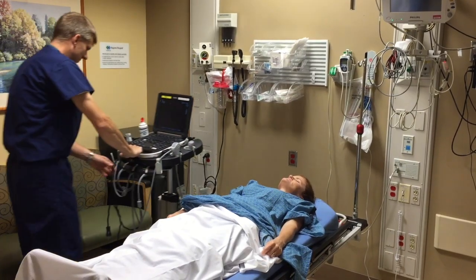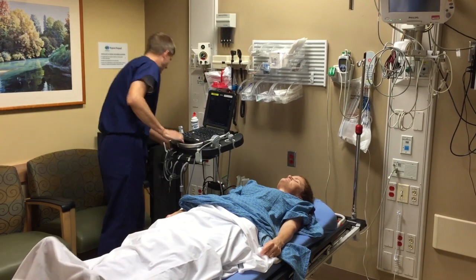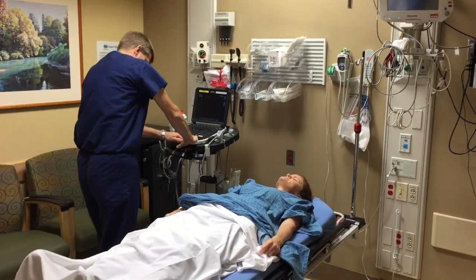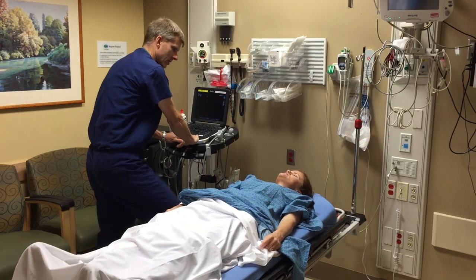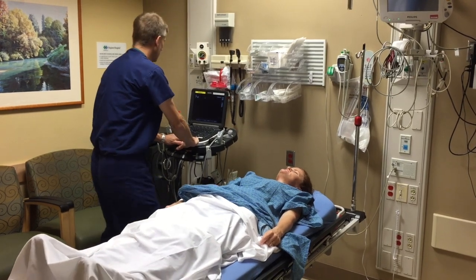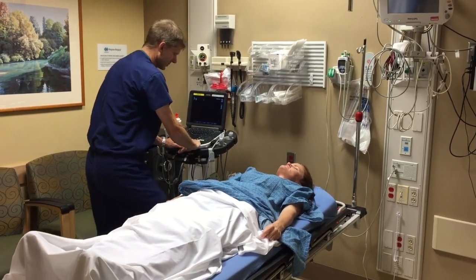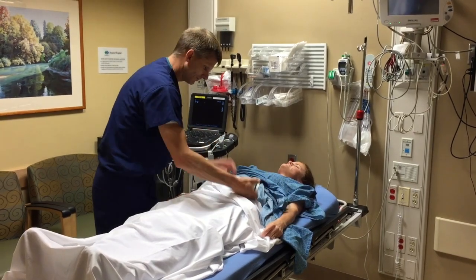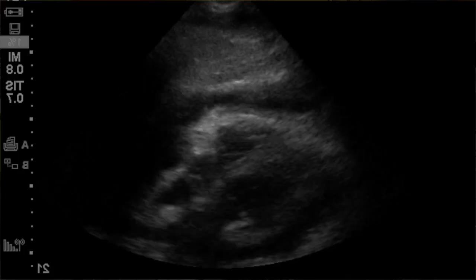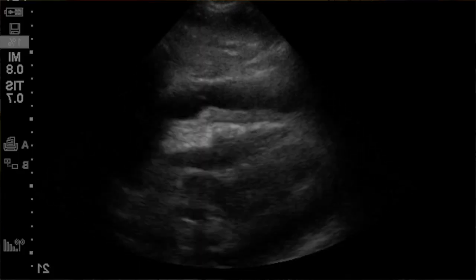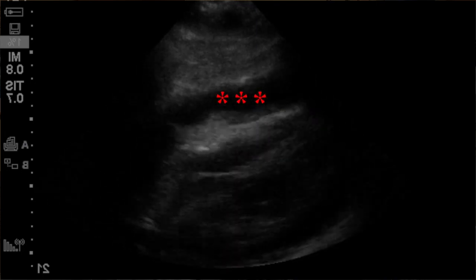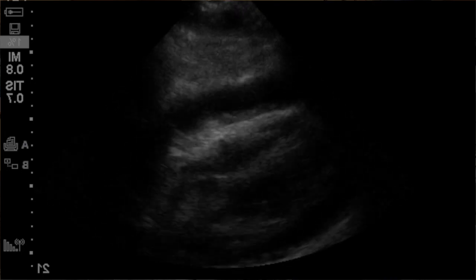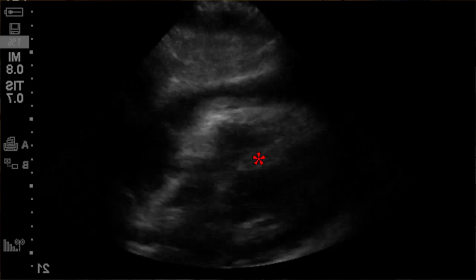Hey there, I'm Dr. Pizodi. Patient can only say their name — let's see if ultrasound can help. Starting the HI-MAP protocol with the heart. Wow, right off the bat — big pericardial effusion. The right ventricle is pretty collapsed.